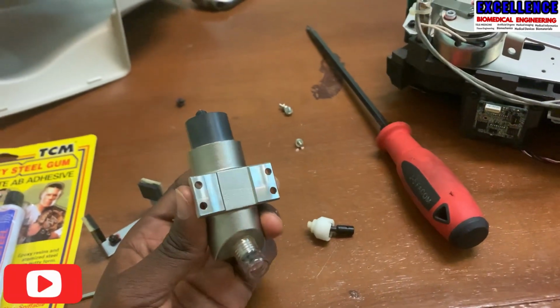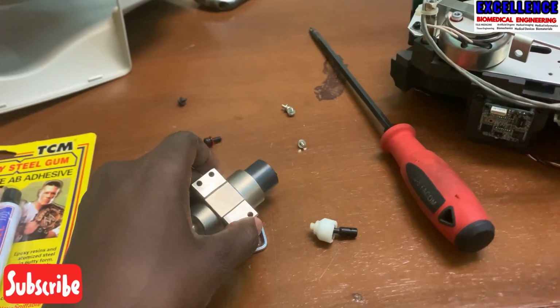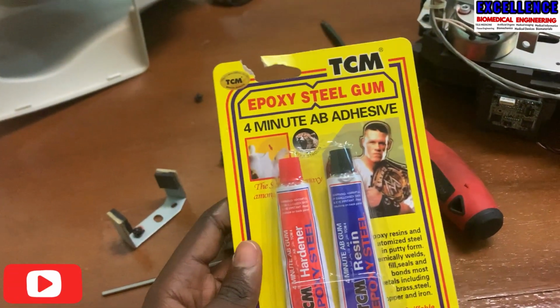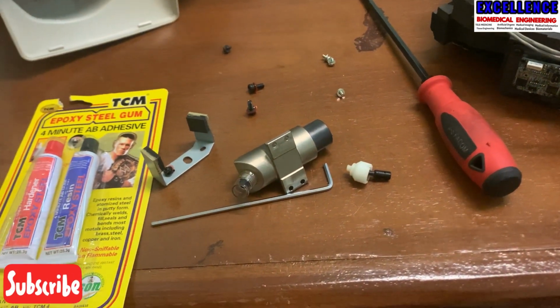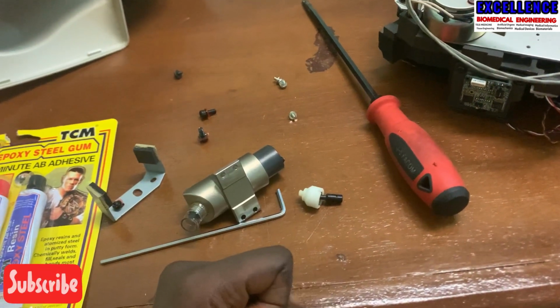Sometimes getting these spare parts might take much time, and depending on your location, maybe they're not even available in time. So what you do is get some adhesives like this, 4 minute adhesives. This is not an advert though, but I got this adhesive to get it fixed. So let's see what will happen.